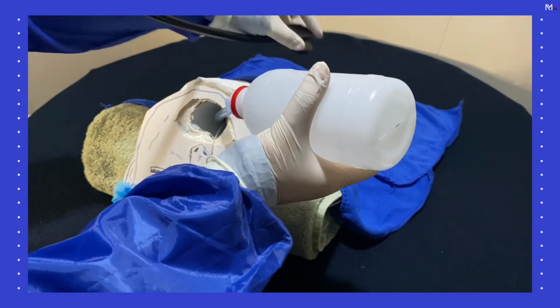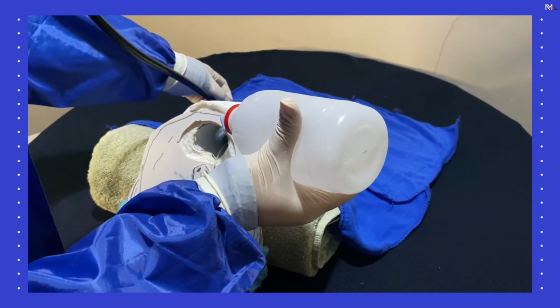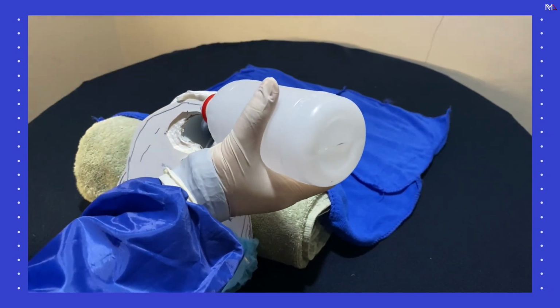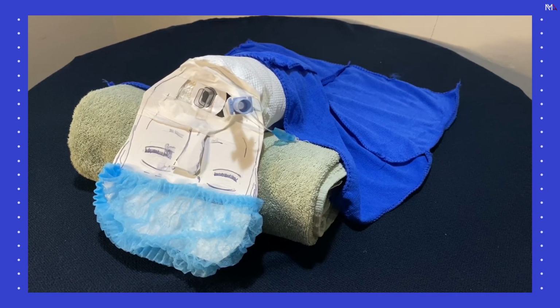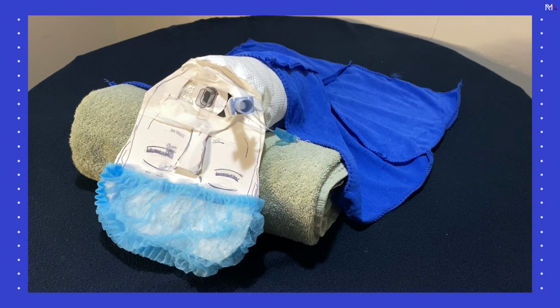Auscultate the lungs for equal breath sounds and the epigastrium for absence of gurgling sounds, as well as check for the chest rise to confirm the placement of the endotracheal tube. Secure the tube with plaster at the right corner of the mouth. An oropharyngeal airway is then inserted as a bite block to protect the endotracheal tube.